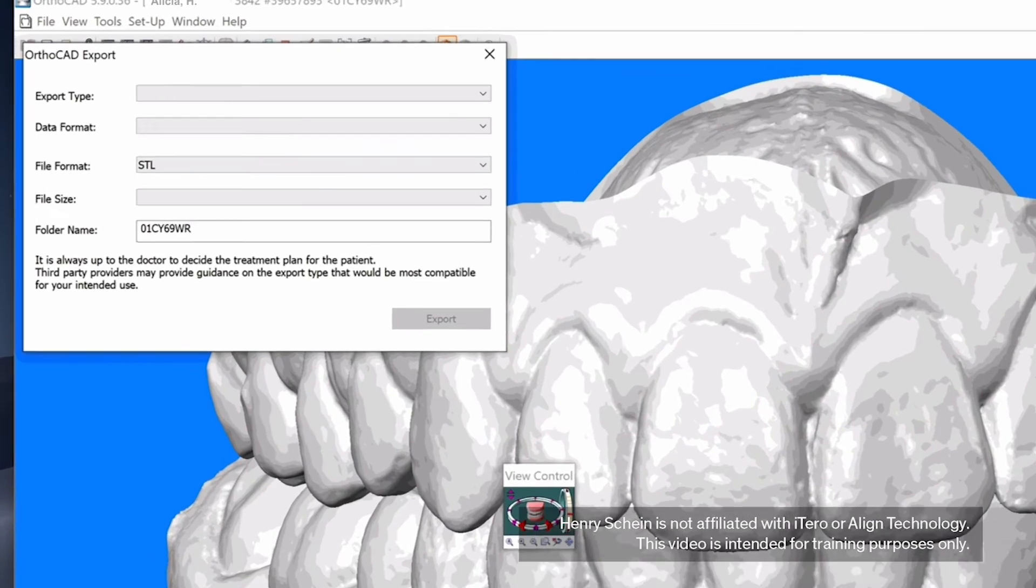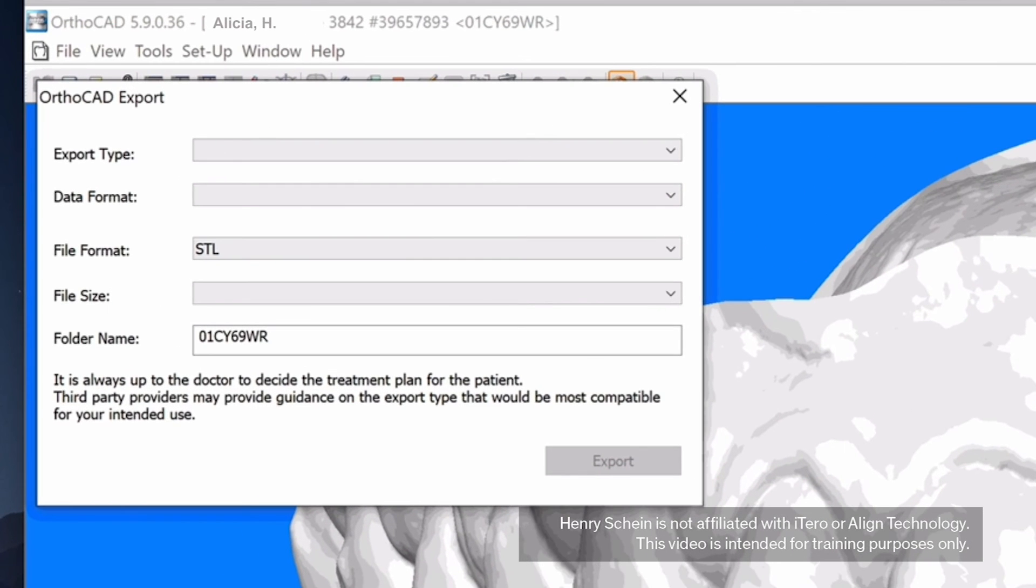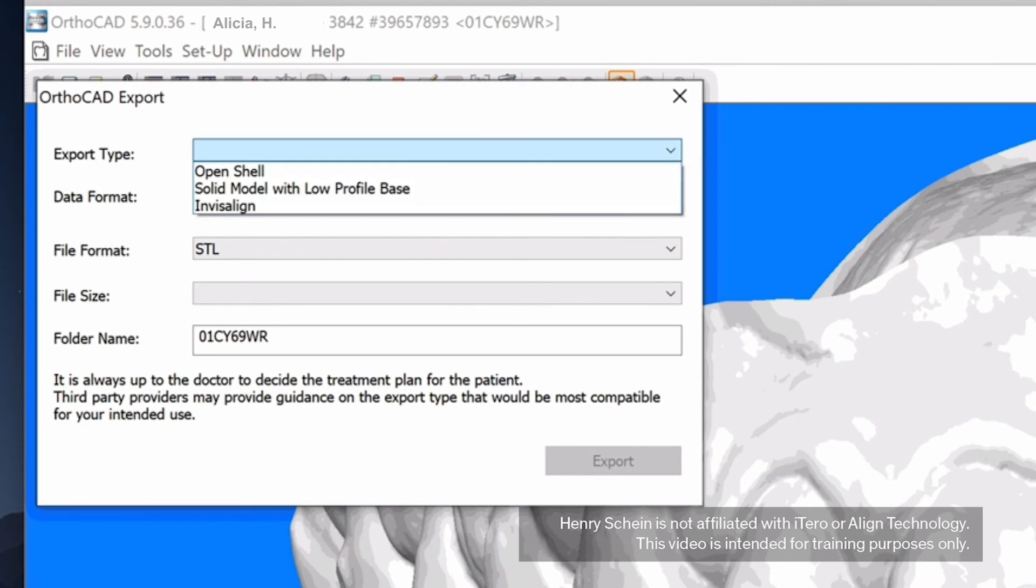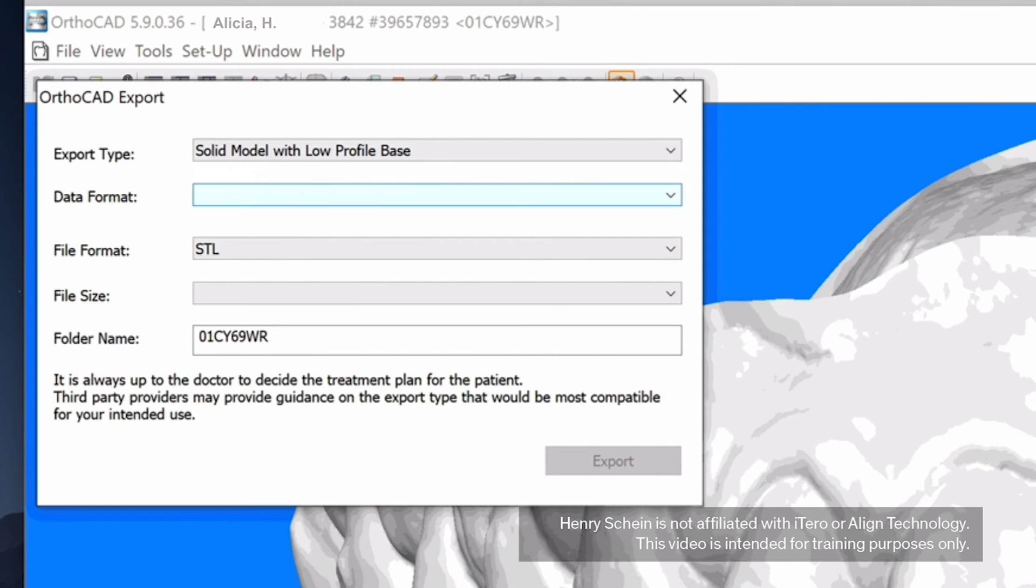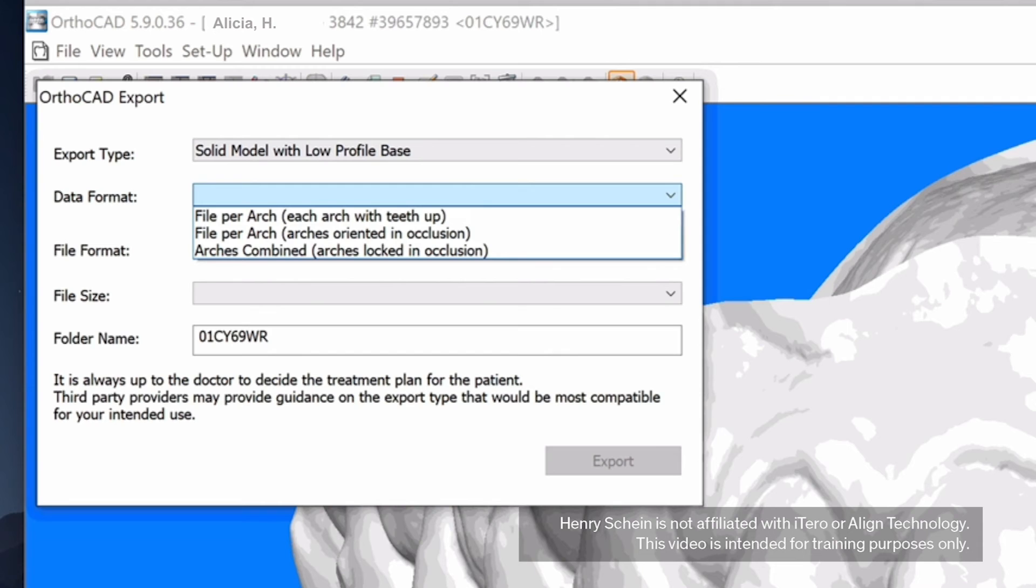Choose the following options. Export Type: Choose Solid Model with Low Profile Base. Data Format: Choose Files Per Arch, Arches oriented in occlusion.